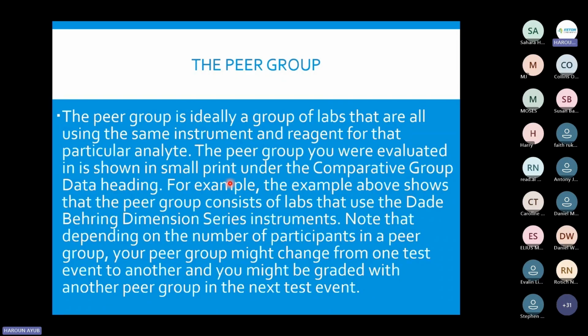And then we have a very important group that is usually called method. Now, method is dependent on so many factors or so many machines. So we'll have ALT using the IFCC method. You find these manufacturers are using this particular method for analysis. So out of 40 different machines, they are using the same kind of method, so we are able to group them. And this usually points out a very clear distinction when we are analyzing.